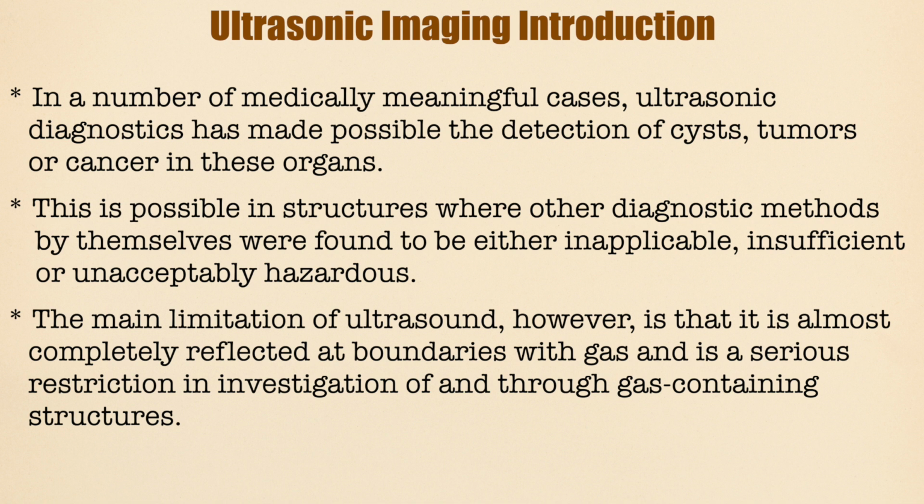This is possible in structures where other diagnostic methods by themselves were found to be either inapplicable, insufficient, or unacceptably hazardous. The main limitation of ultrasound, however, is that it is almost completely reflected at boundaries with gas and is a serious restriction in investigation of gas containing structures.